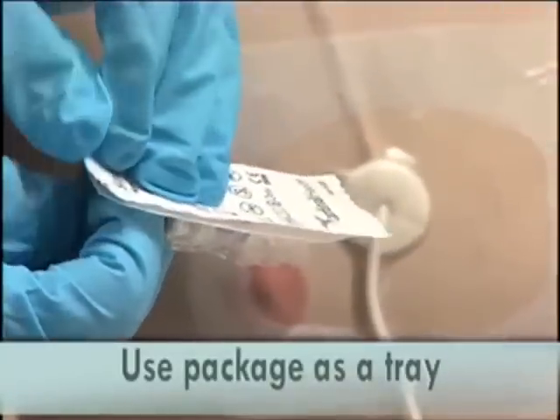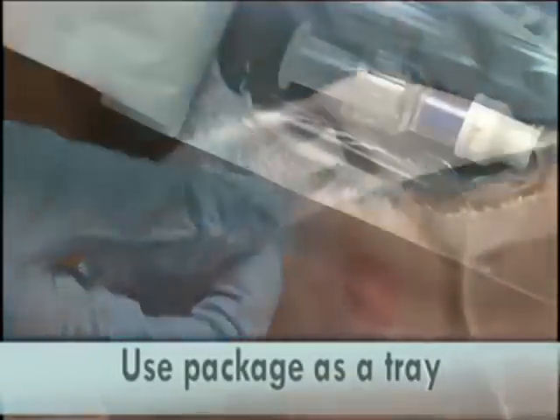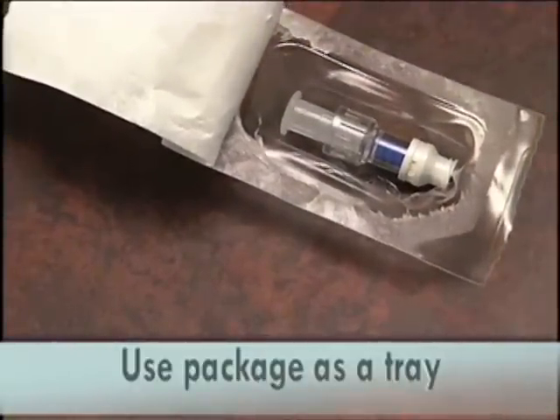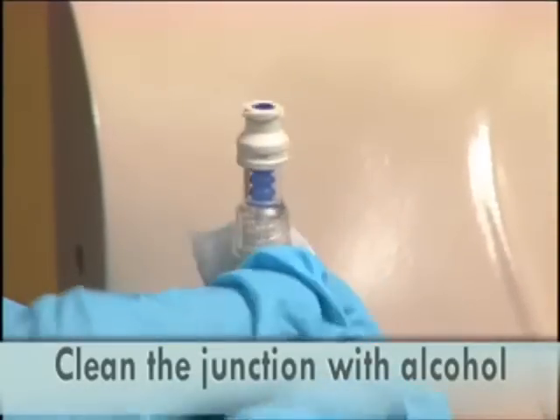Open the end cap package and set aside, using the bottom of the package as a tray. Be careful that the cap remains in its package. Wipe the junction of the cap and line with an alcohol wipe.